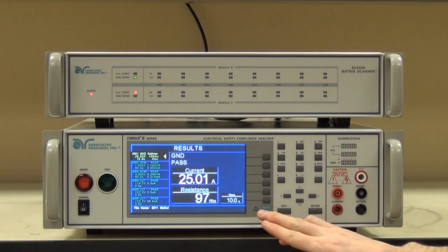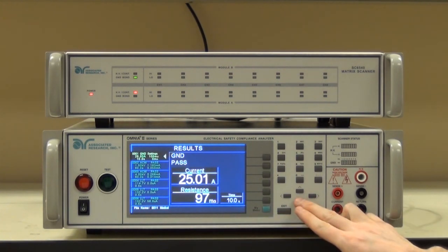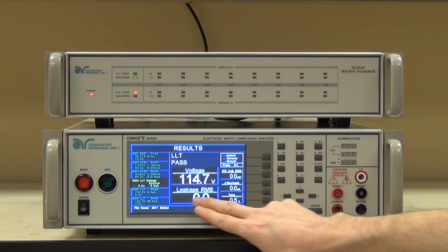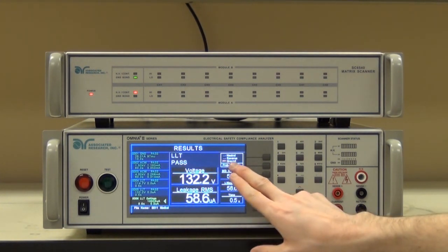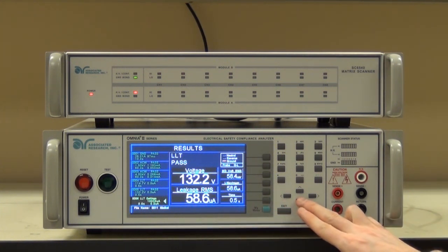Now we can look at the results. As we can see, we passed our ground bond test at 25 amps of current at just under 100 milliohms. Mains AC high pot at a little over 1 milliamp of leakage current. Patient lead high pot at about 260 microamps. Earth leakage test under normal conditions with pretty much no leakage. With an open neutral, with almost no leakage. Now we have an open ground, and as you can see, since the measuring device is not shorted out any longer, we're actually getting a higher value — about 58 microamps — but still well within limits. And this follows for the rest of the leakage tests.